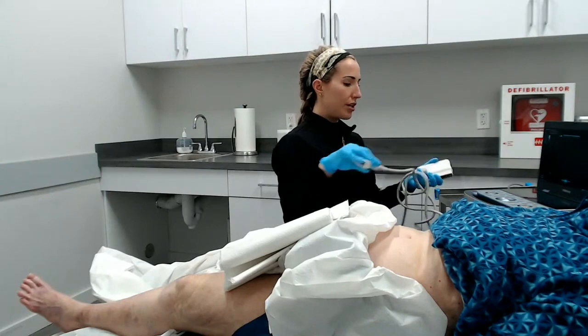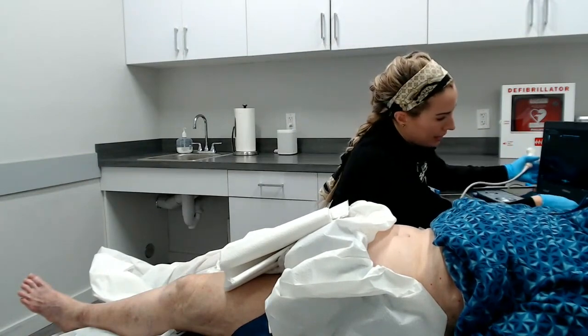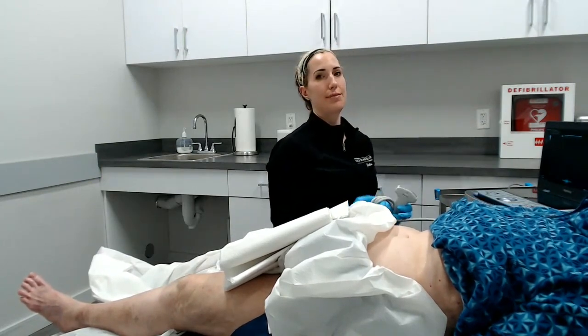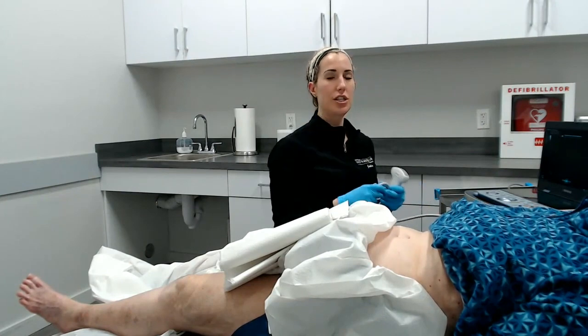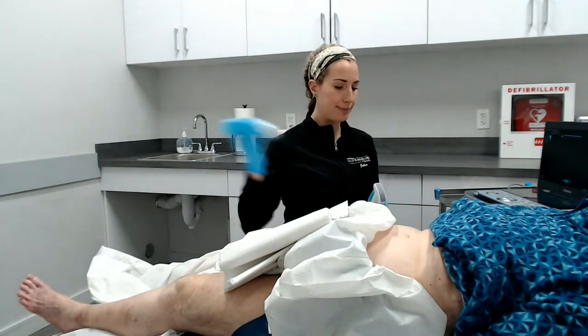So I'm just going to plug in my curvilinear transducer. So typically when a patient has intervention, whether it's thrombectomy or stent placement, we surveil these patients over time. So it's a 1 month, 3 month, 6 month, 12 month, 18 months sometimes, depending on the physician, and then every year. And then if they're symptomatic, of course, we image more frequently.